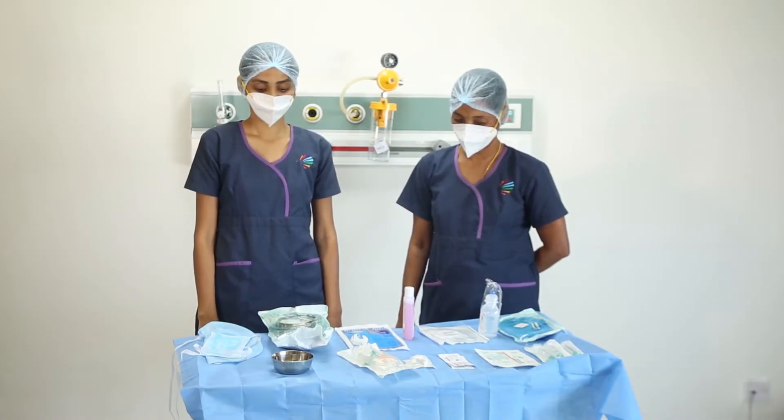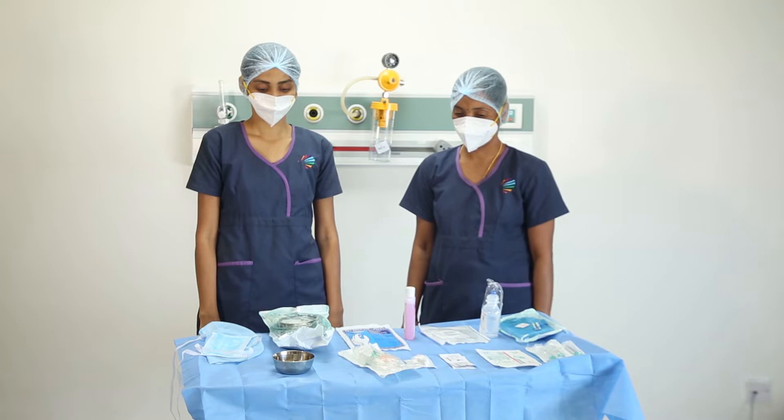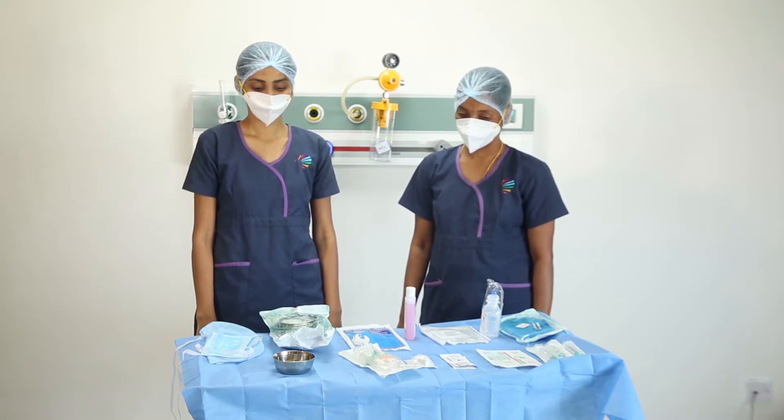In this session we would learn how to access a Hickman line. Sister Sarita and Sister Anne Lois will be demonstrating the procedure.